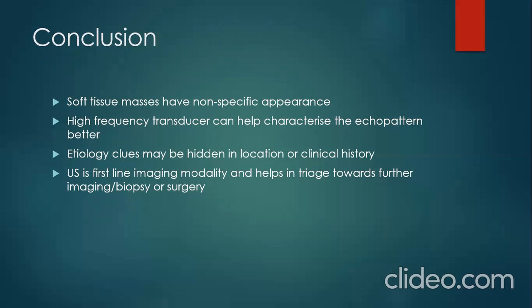We cannot stress enough that you need the clinical history of the patient and the lump that you are dealing with for you to get a clue of what you are dealing with. So just get as much clinical history as you can. Don't overlook this. And most of the time, ultrasound is used as the first imaging modality, as this helps triage patients towards further imaging or biopsy or sometimes surgery.